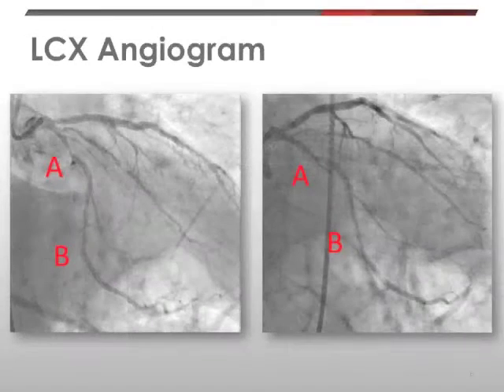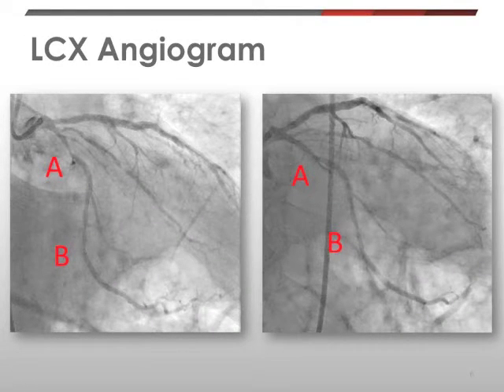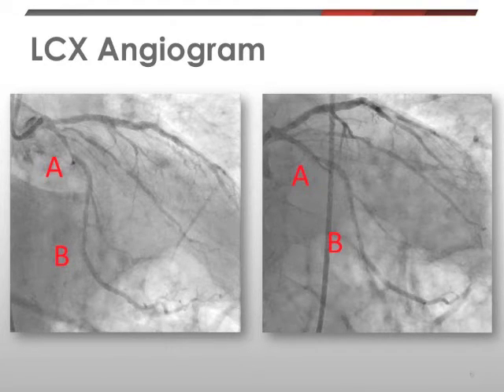As you can see from these pictures, we've now labelled the potential stenoses identified from the first angiogram. The proximal one we've labelled A and the more distal one we've labelled B. From these images it's not immediately apparent from the angiograms which is most significant and which would potentially benefit most from stenting.